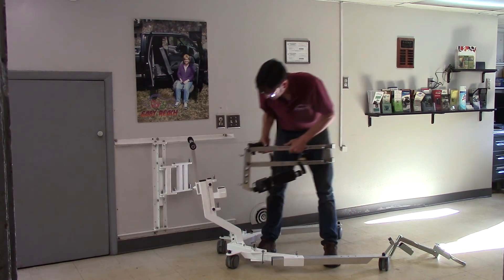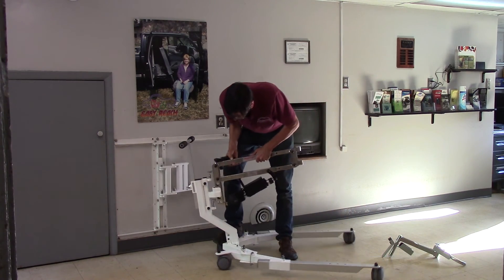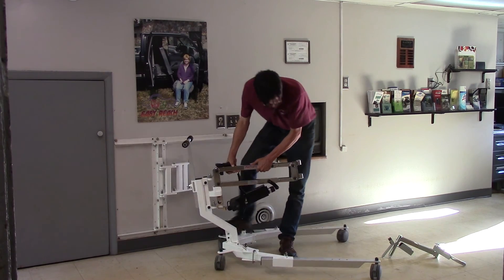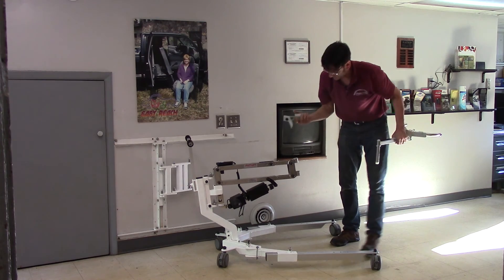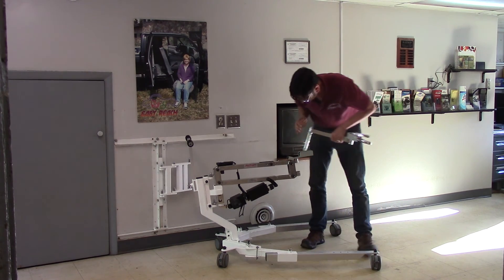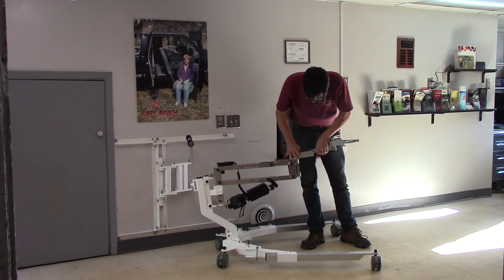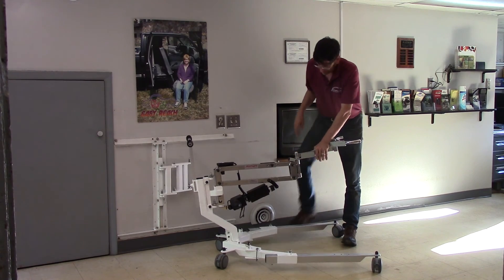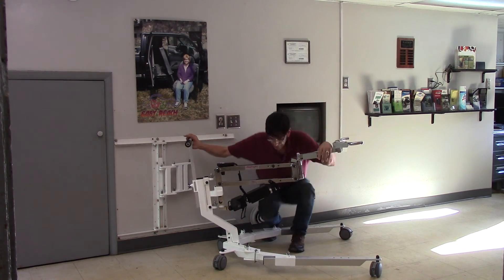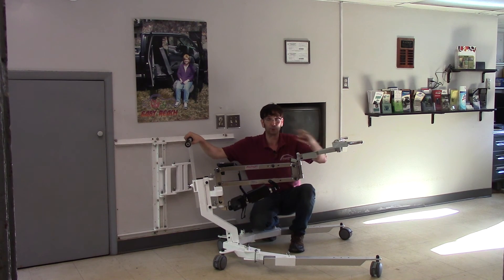Next step, put the lift in place. I'll show you the individual components: the swing arm motion limiter and the spreader bar motion limiter. And there you have it — the multi-lift EZ-Base collapsible version.